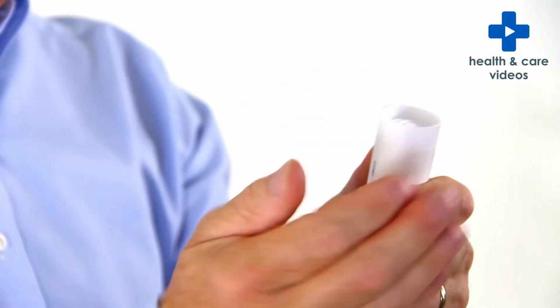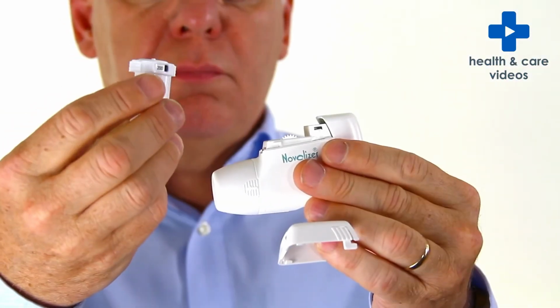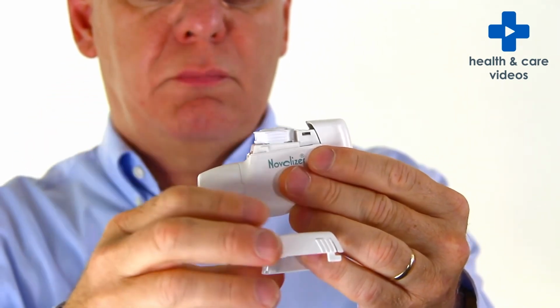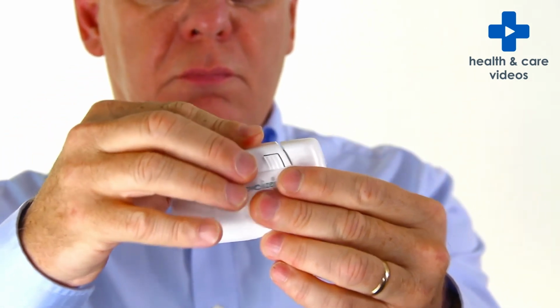Remove the cartridge from its sealed container and insert it into the inhaler with the counter facing towards the mouthpiece. Replace the lid of the inhaler by pushing down and backwards until it clicks into place.